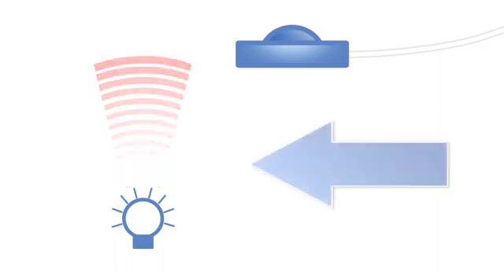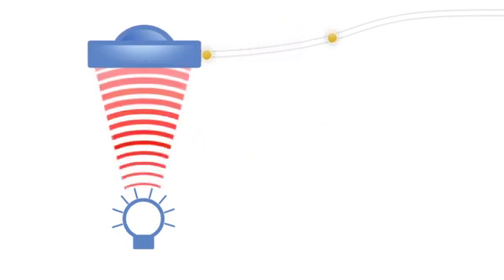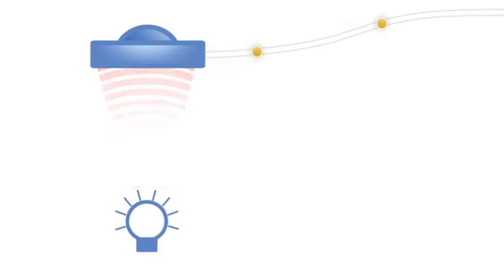The emitter and detector should rest across from each other at the base or center of the fingernail and the pad of the finger.